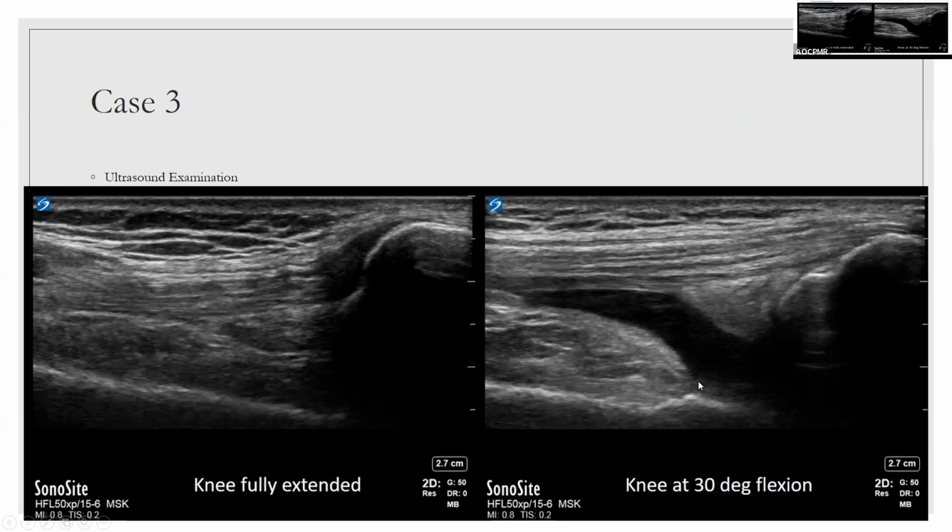Once you see this kind of effusion, you'll also see the effusion start to show on the sides. It's called saddle bagging. It will start to peek out on either side of the medial and lateral knee, especially superiorly. So what you actually do with the needle in this view is poke through in short axis and drain the knee from here. I think we drained 20 cc's of fluid from her, which isn't a ton, and then put a little bit of steroid in there just to make her feel better. The reason it felt tight and stiff is because she had a joint effusion. So when you try to fully flex the knee and patients have pain, that's usually because of a joint effusion.